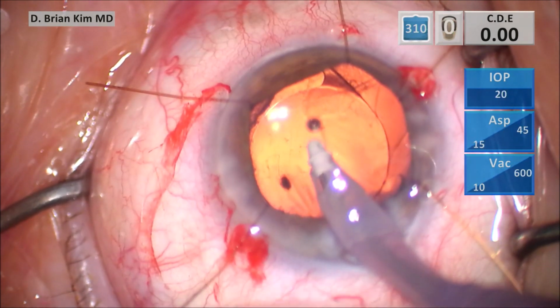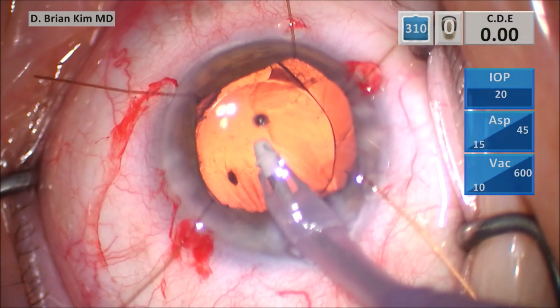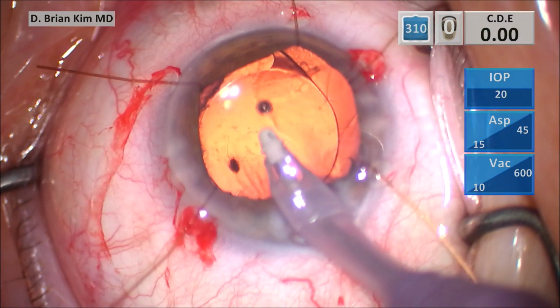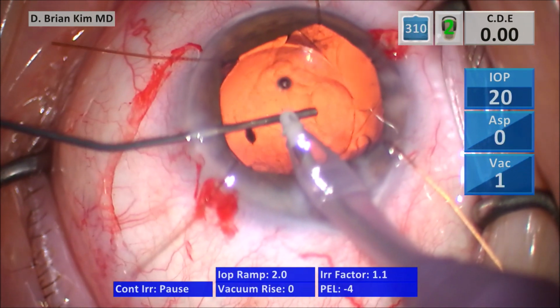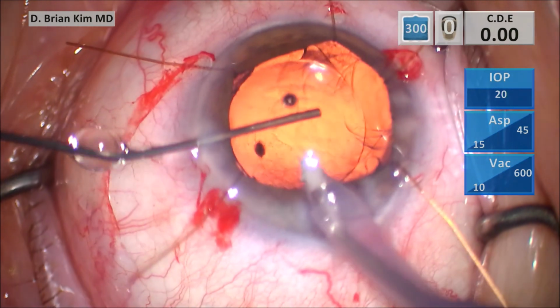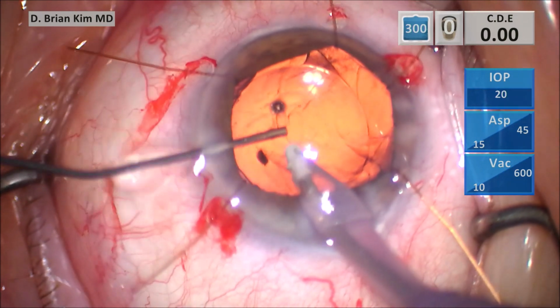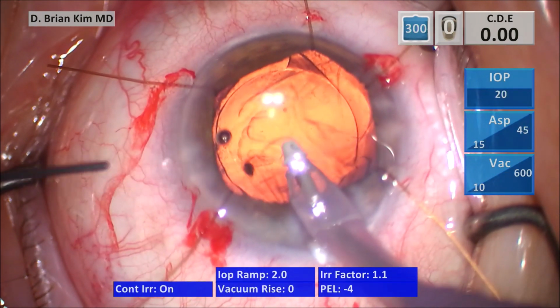But then I noticed something. Something doesn't seem right. And what I noticed right here is there's a localized posterior capsule hole. And I'm not sure how and why that happened. I'm not sure if that's an extension of the anterior capsule tear that was there, but it's round. It's not like a radial tear.